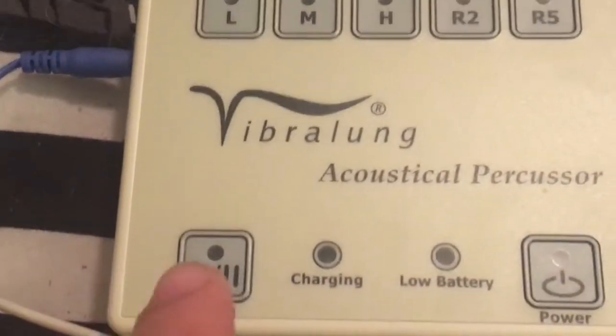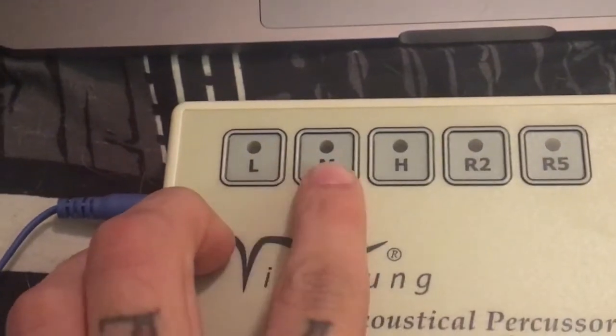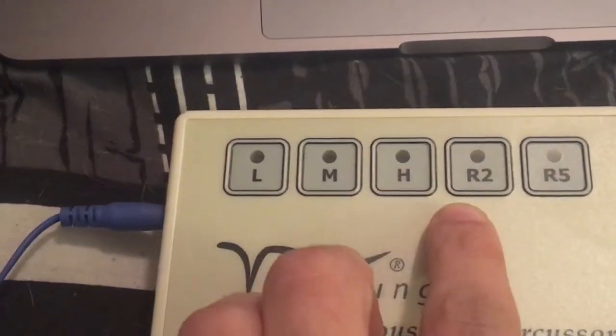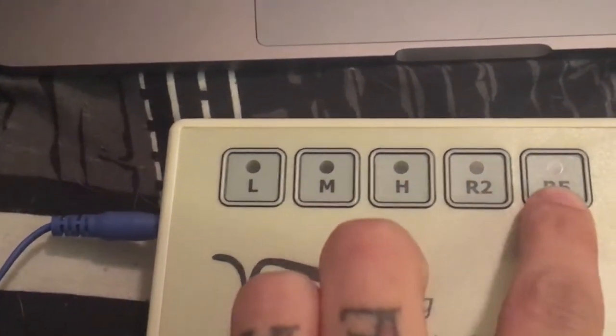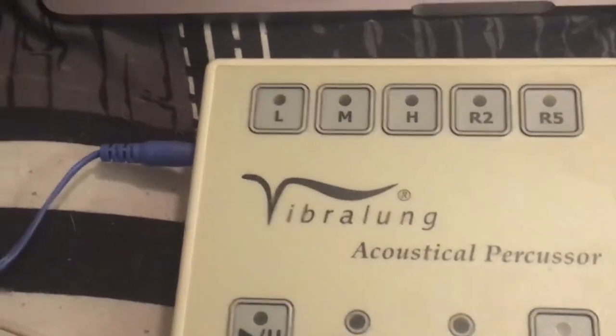You have, of course, a power button, pause and start — the usual. Right here you have the low, medium, and high. And here you have the random noise two and random noise five, which is basically white noise, and I'll show it to you guys.